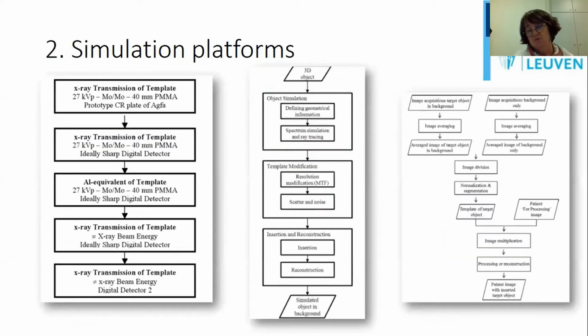Then once we have lesions, and I just repeat, it is now possible to multiply the amount of lesions by applying AI techniques on all these different models. That's done also. Then we need simulation frameworks, and there are also several approaches there.